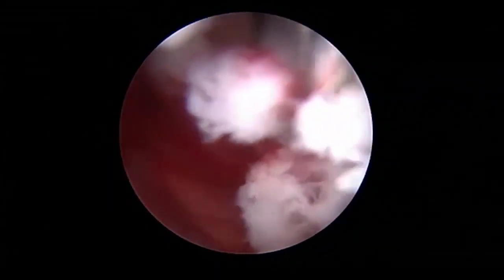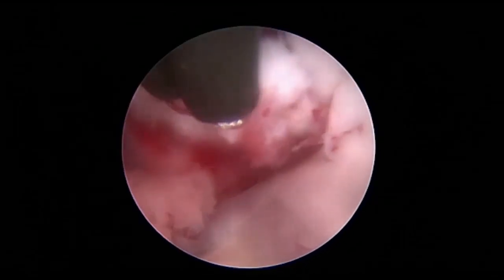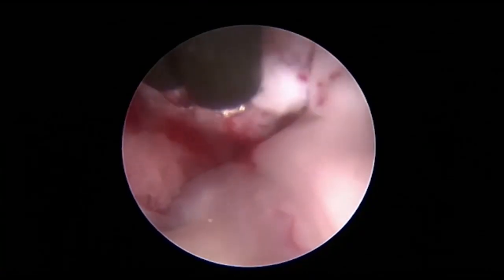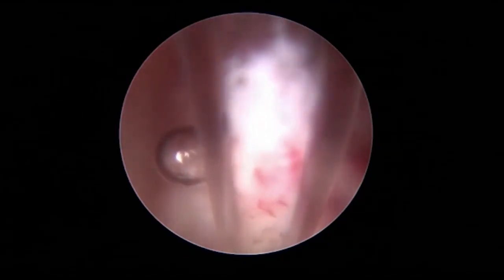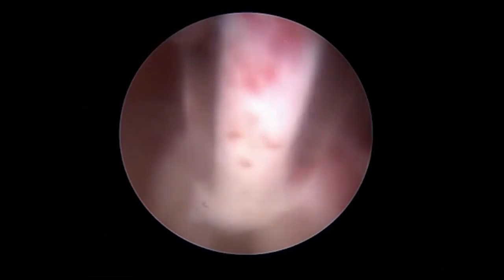You can see the attachment to the choroid plexus here on the bottom left, and we are coagulating the attachment there and further removing it. This is aspirating the tumor using a pediatric feeding tube, which is placed over the tumor to aspirate it directly, and then removing additional portions with the grasping forceps. So this is done in a piecemeal fashion, gradually exposing the normal intraventricular anatomy. You can see the septal vein once again on the left side and the normal ependymal wall.